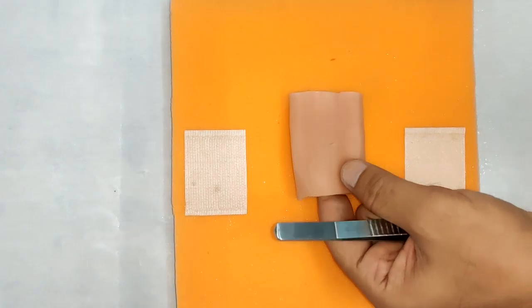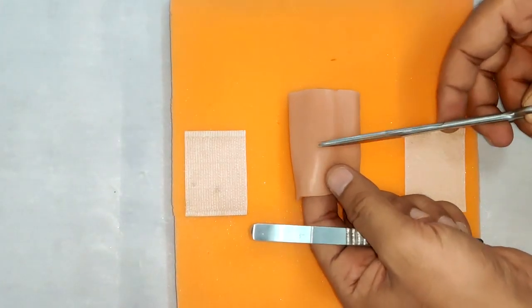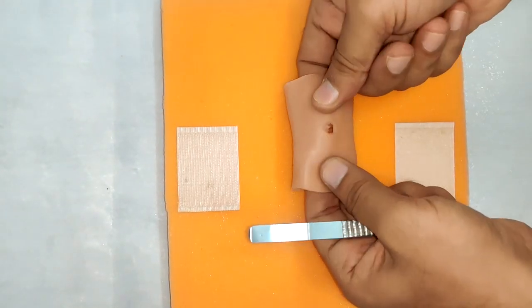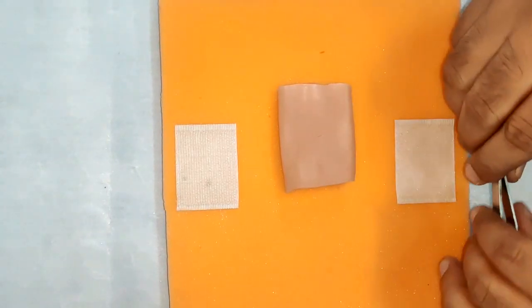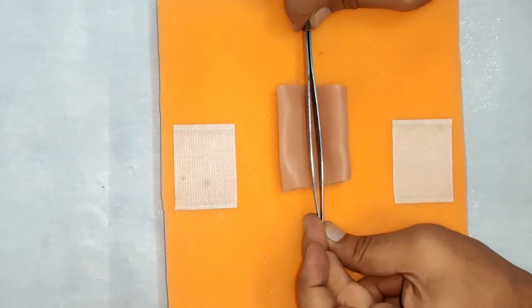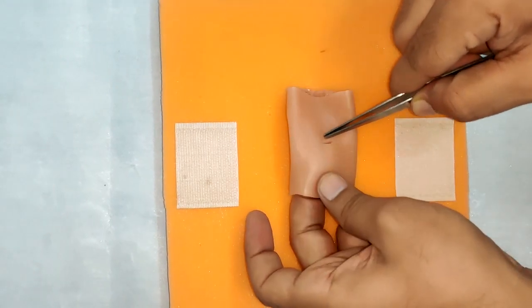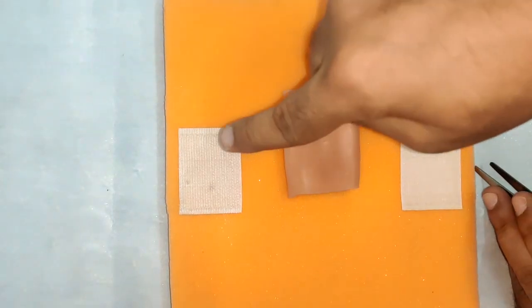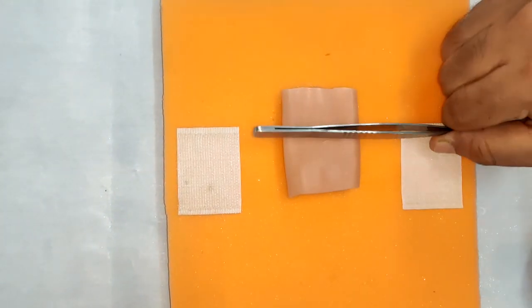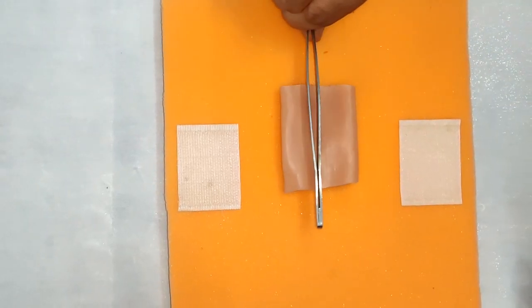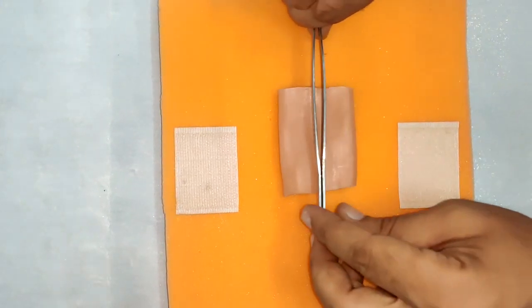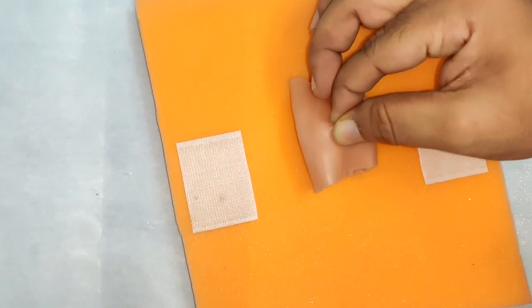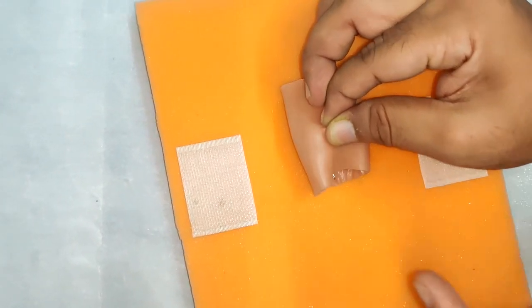Now, any perforation, be it in any direction or orientation, the primary objective is to suture perpendicularly. If we suture along the axis of the bowel, there is a possibility of it getting kinked and the lumen will be compromised. Whereas, if we suture perpendicularly as suggested, the lumen will increase in size, which will give it a rid advantage and safety.